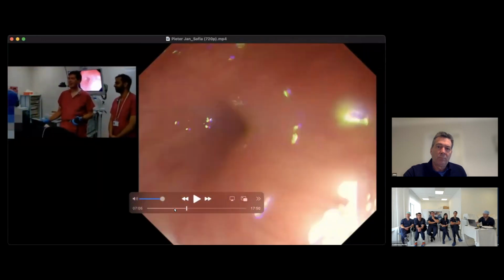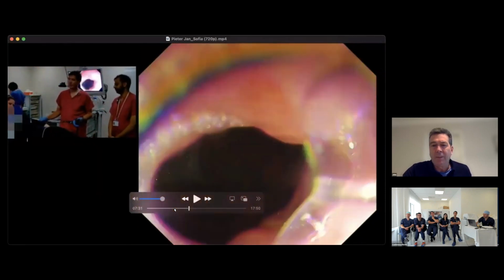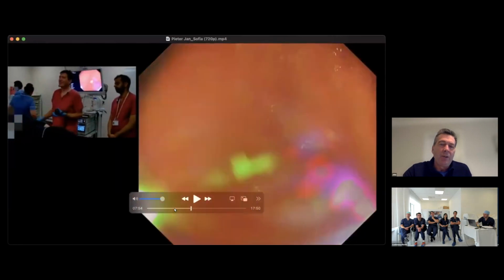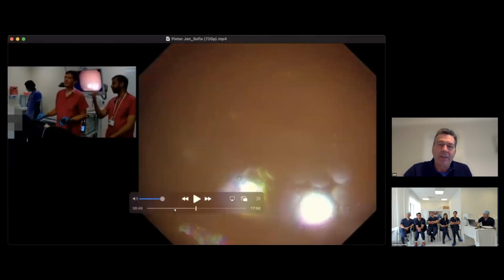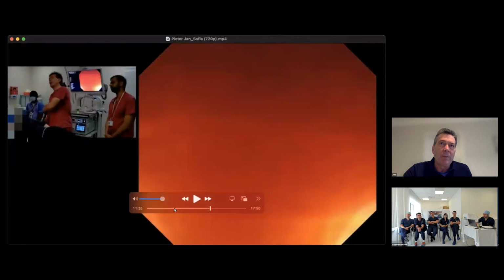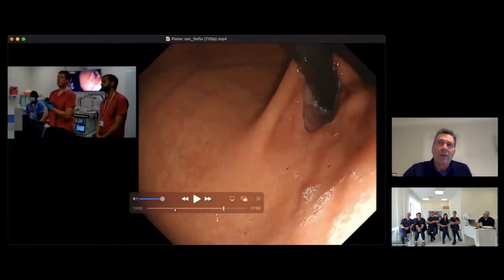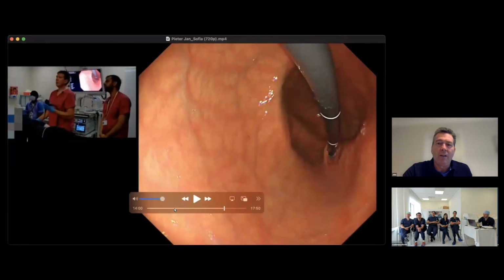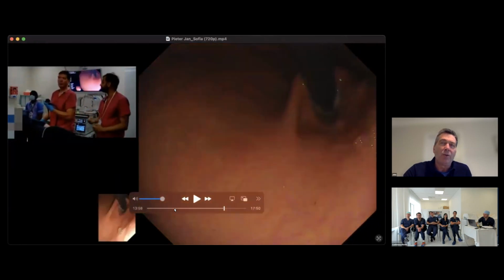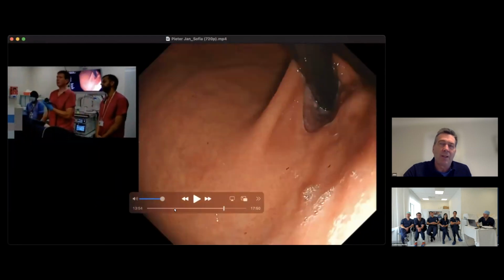Yes. You got some comments hearing that, John? Yeah, it's my standard practice. We're training people to develop their endoscopy skills, and you also talk about pre-test probability. This is an area where the relationship between symptoms and pathology is not always there. However, there are certain symptoms which require a bit more attention, and dysphagia is one of those. With dysphagia, it's not just is there a physical obstruction, but is the motility normal? Is the esophagus dilated? Are there any changes to the mucosa? Again, you're looking at the OG junction. Is that lax? Could that be causing a problem?